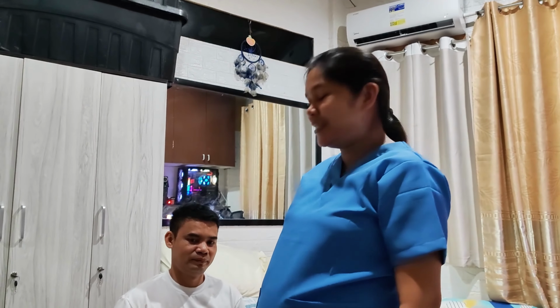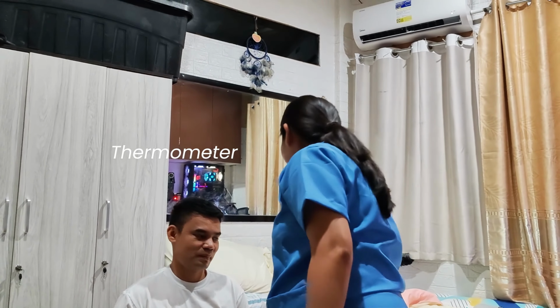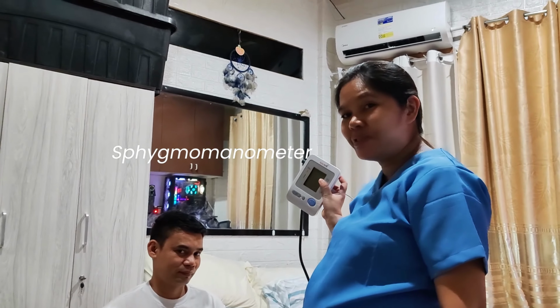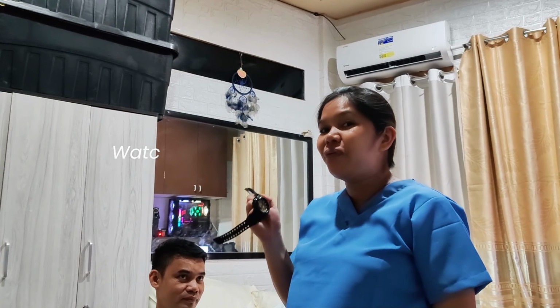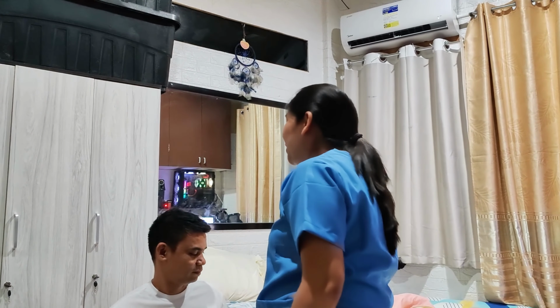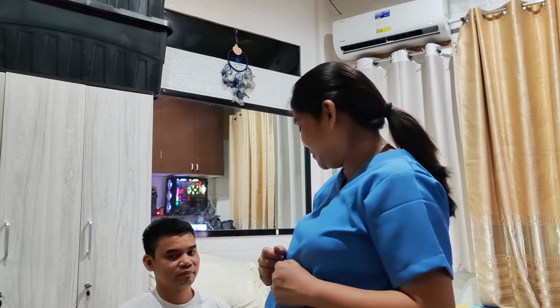Now let's have the demonstration. I will be using a thermometer, a sphygmomanometer, and a watch with a second hand. So first, let's take the temperature of the patient.